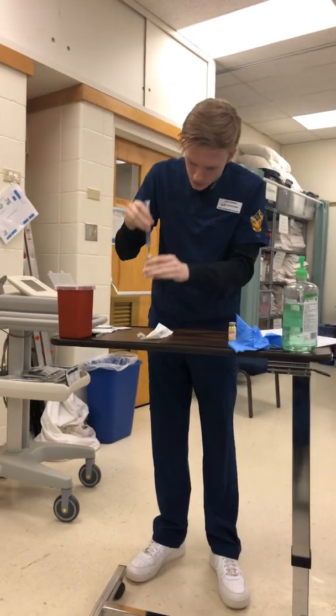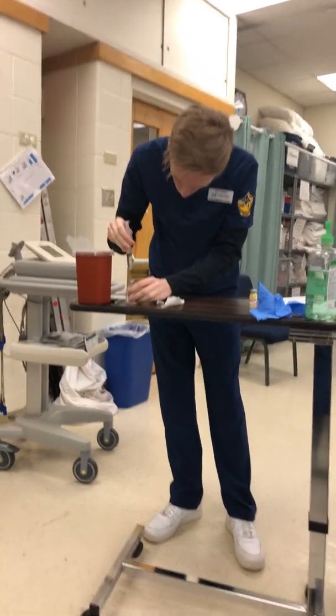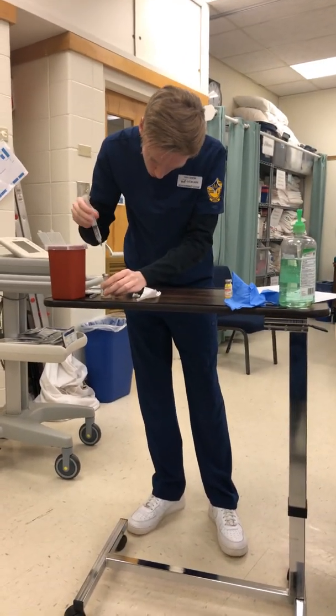We got 5.6 mils of diluent. We have no bubbles, or else I would tap them and get the bubbles out.